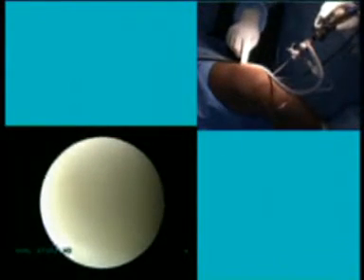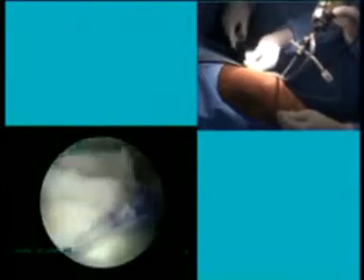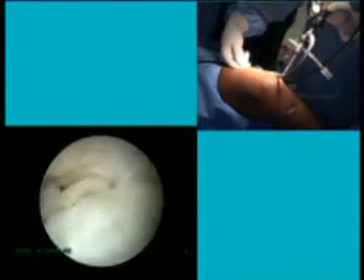I didn't catch that. Which side do you use the bone on? So you don't use any screw in the femur in the press fit fixation? Yes, no screw. Okay. Can you give me the suture grasper?